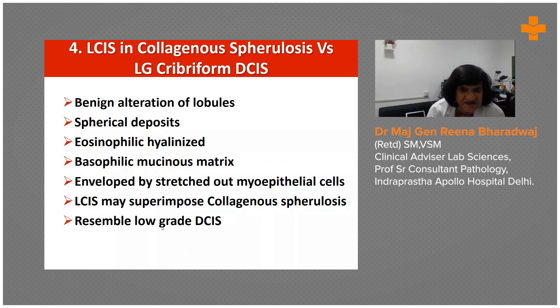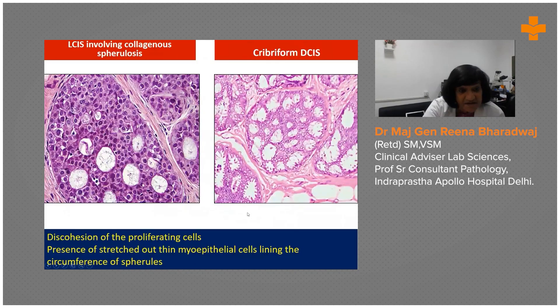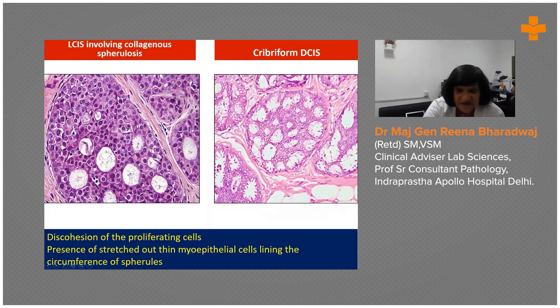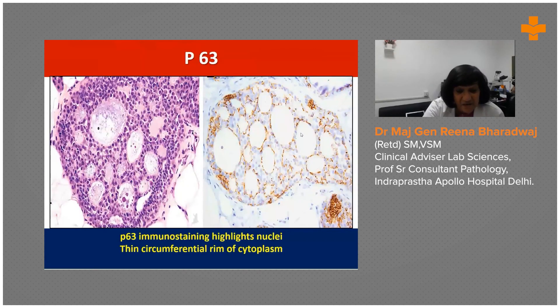When LCIS is associated with collagenous spherulosis, you will see spherical deposits of eosinophilic hyaline material and basophilic mucinous matrix enveloped by stretched-out myoepithelial cells. Here you have collagenous spherulosis with discohesion of proliferating cells and stretched-out myoepithelial cells around the circumference of the spherules, while on the other side there is a cribriform DCIS — very punched out, though the cells are quite monomorphic. If still in doubt, use P63, which will highlight the nuclei circumferentially in a rim around myoepithelial cells in case of LCIS.